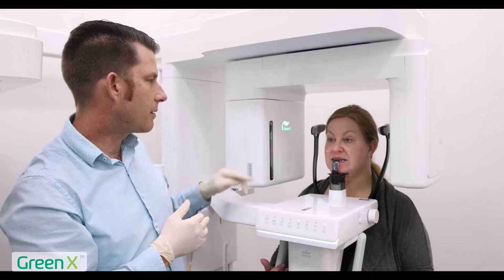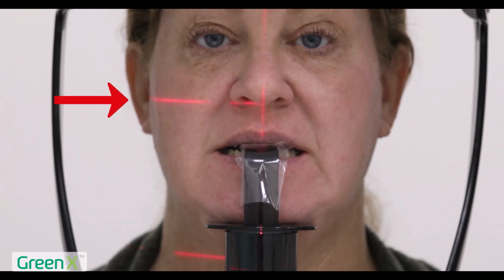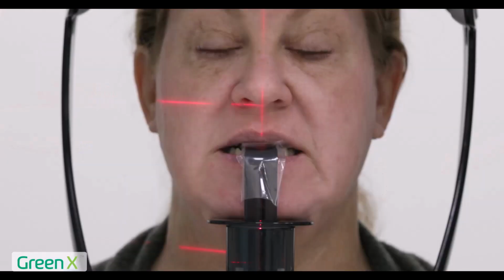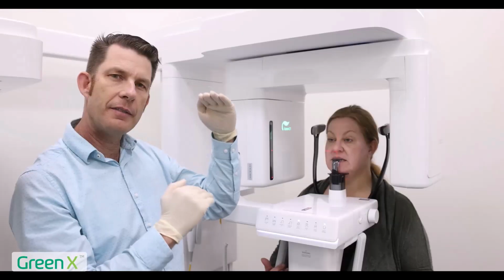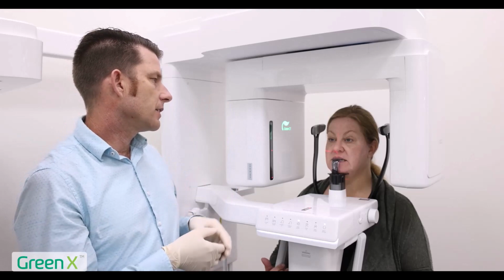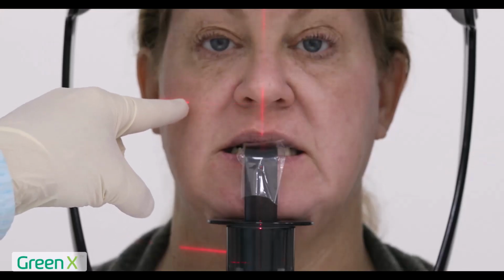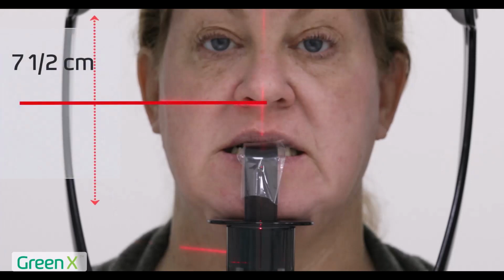A couple things to note. We have a horizontal beam shining on the right side of the patient's face. Depending on the field of view you've chosen, depends where that horizontal beam will be located. The important thing to remember is that the horizontal beam is the center of the height. So if we have a 15 centimeter in height scan, we're going to be capturing 7.5 centimeters above and 7.5 centimeters below.